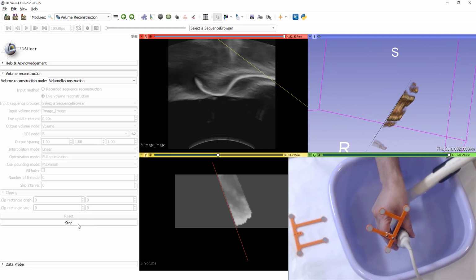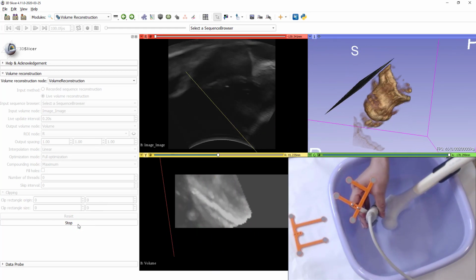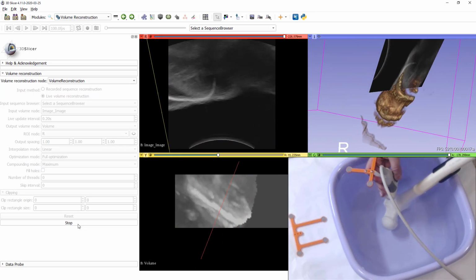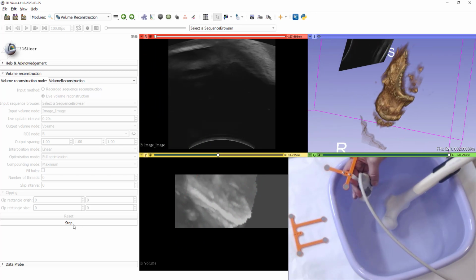The first example shows the maximum compounding. We are scanning a femur head. And we can see as the live volume is updating both in the 3D viewer and in a 2D cross section.